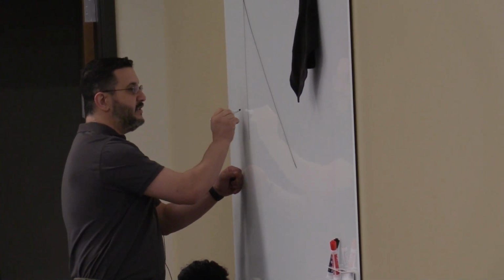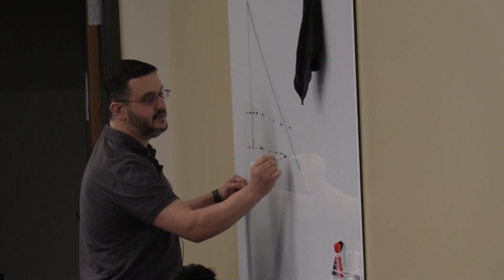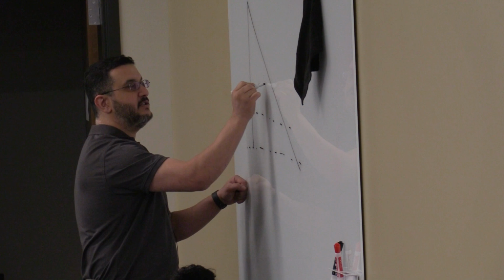At 25%, just like he said, once I get to 25 liters a minute, so my graph starts off at 100, and I can't stay at 100. I'm going to start ramping down. Once I hit 25 liters, the breath gets cut off. So if someone's taking a big breath and I want to cut them off earlier, I can cut them off by increasing that percentage. Instead of cutting them off at 25 liters a minute, I can cut them off when they reach 50 liters a minute. If I'm at 25%, let's pretend a normal breath is 4 liters, like a flow rate. That is not correct, but 4 liters here. We're just going to do 4 hash marks.